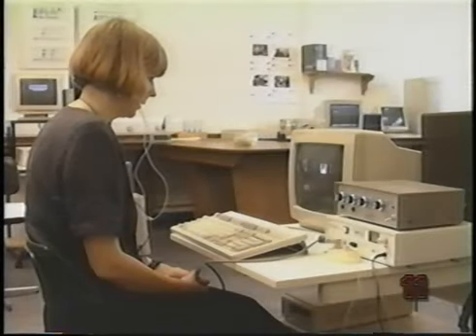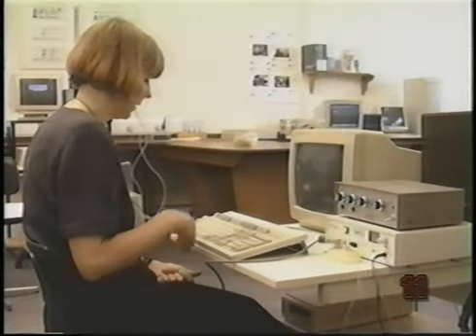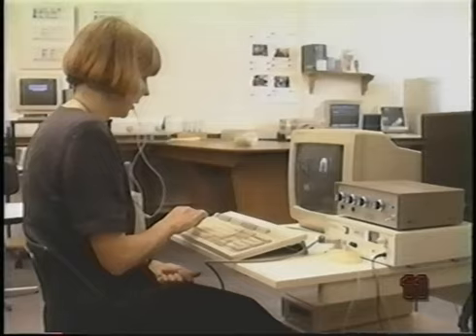Different manners of articulation can also be illustrated with EPG. Alveolar and post-alveolar fricatives show characteristic patterns of contact. First, alveolar fricatives. Asa. Asa. A narrow central groove can be seen clearly along with full lateral contact.